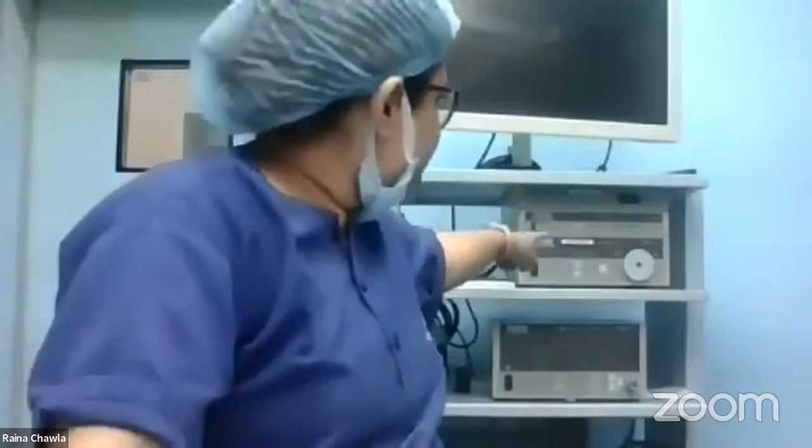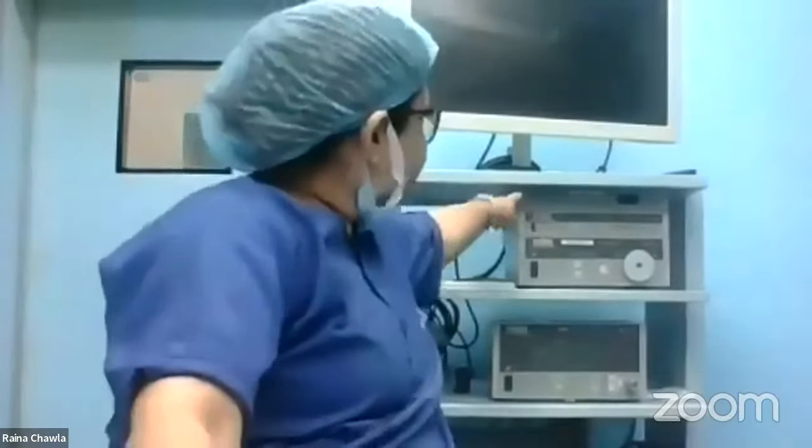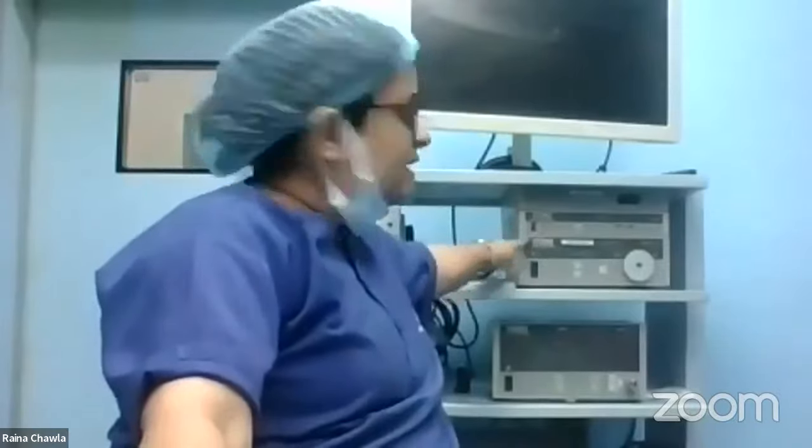Okay, so now you can see behind me, this is the laparoscopic tower. I hope it's visible. We have a monitor on top. This is the camera system, and this is the light system. The top one is the camera system. This one is the light system.